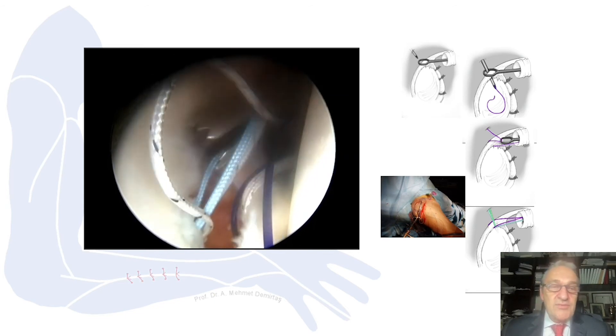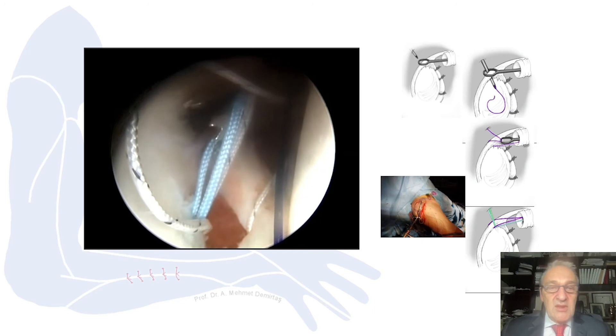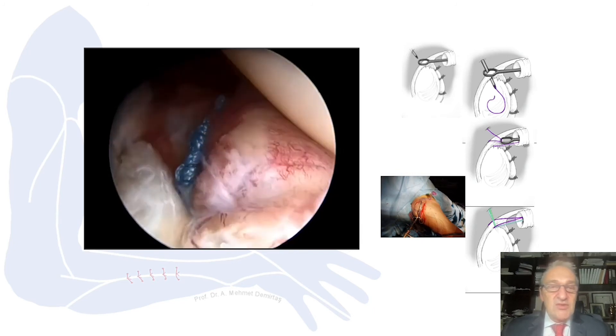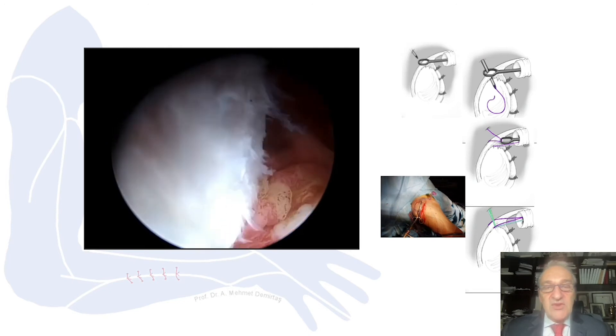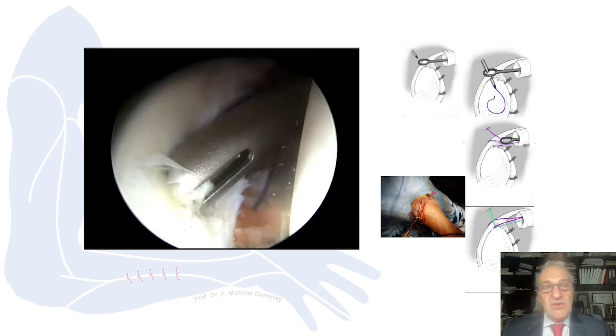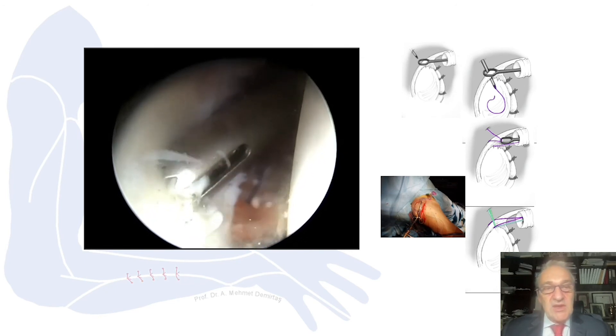We release the tissue, put our anchors, and then use the sutures to tie them — performing three sutures in the same style. After completing the Bankart repair, we are going to repair the SLAP lesion.